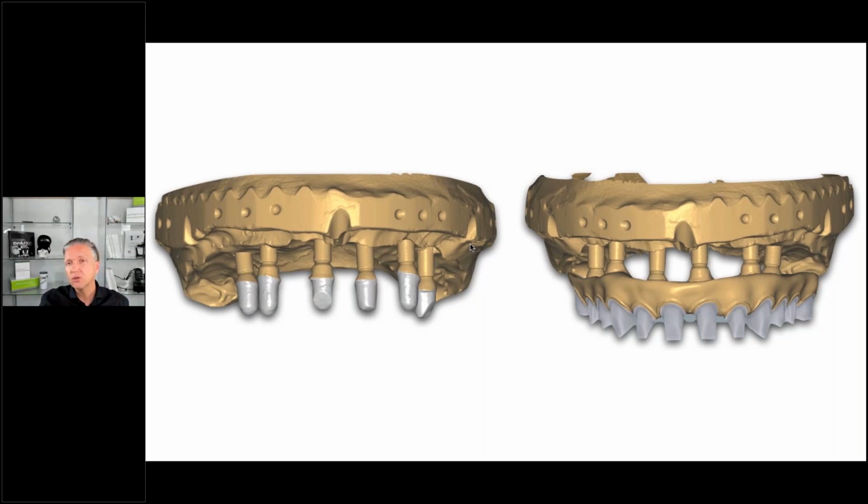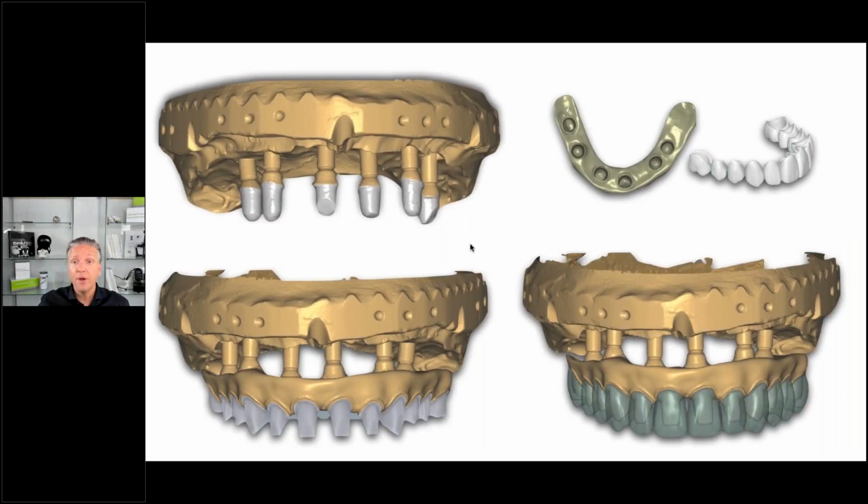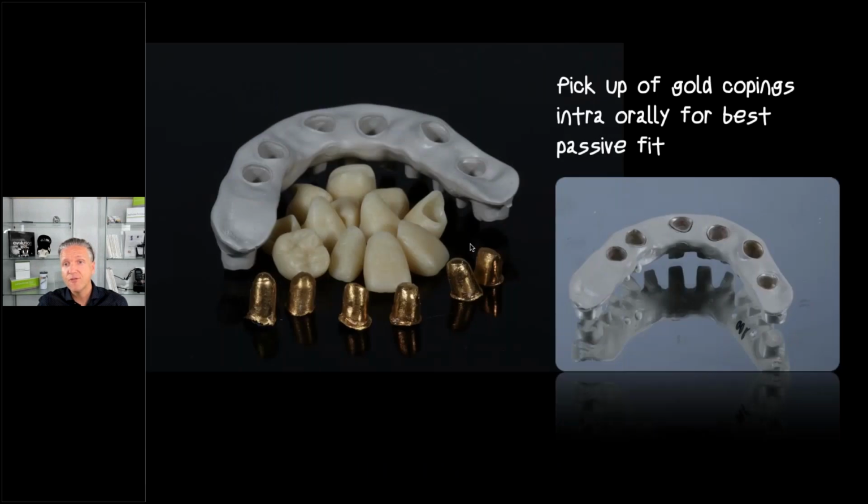So we have to make sure that the restoration is light. And lithium disilicate is light, very light. LiSi is very light. So that's the advantage of utilizing Pecton, which is super light. We're utilizing a crown material like LiSi Press, which is super light, and composite, which is not as heavy either, and can therefore finish a very lightweight, very high-end complex restoration for very good longevity.